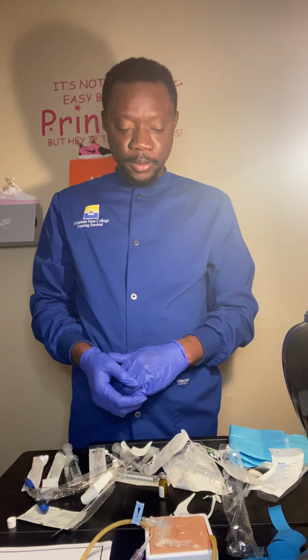Patient tolerated well. IV site looks decent. Okay, so I will also write the medication I administered, the date, the time, and the patient reaction or tolerance to it. And then that's how you start an IV and administer medication. Thank you.